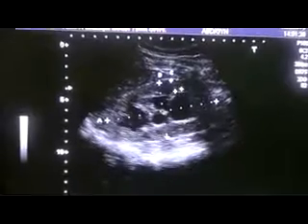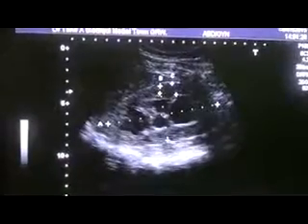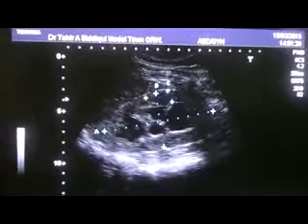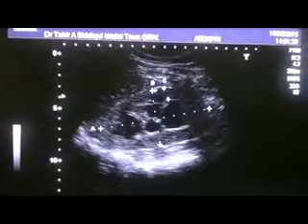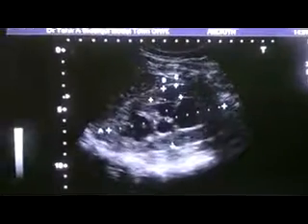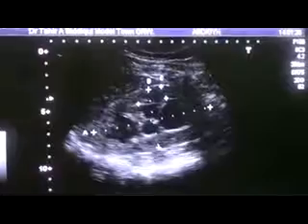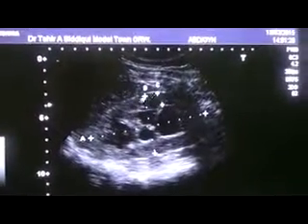Medulla are seen. Pyramids are seen. Intact corticomedullary differentiation. This is what we call, now this is the capsule of the kidney, and an echogenic area just below it is the cortex, and these tiny cystic areas are representative of pyramids. So if you see this, it means that the corticomedullary differentiation is intact and the kidney is functioning properly with preserved parenchymal thickness, or even cortical thickness.